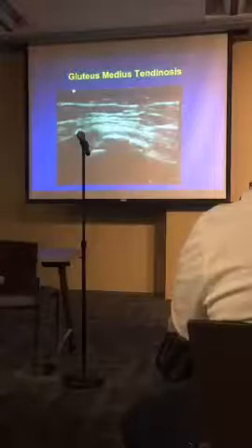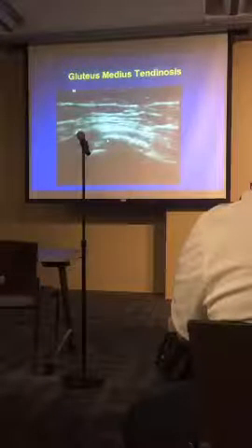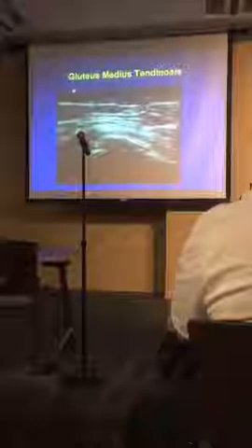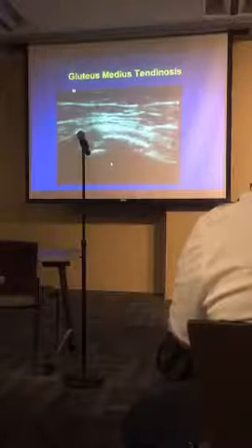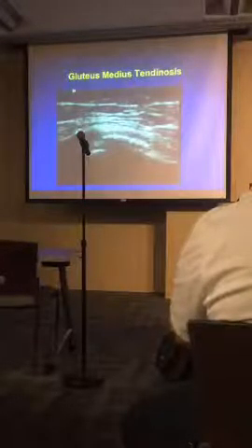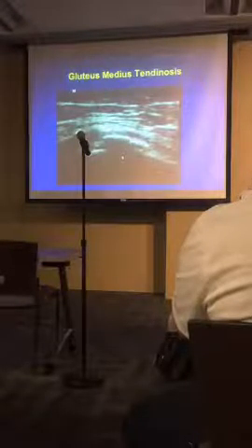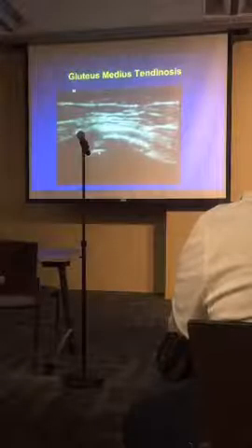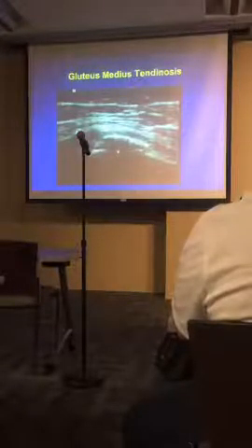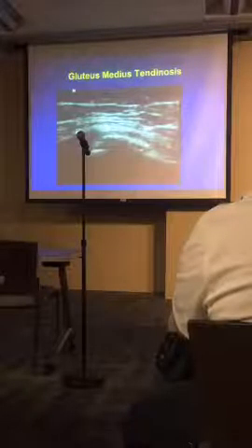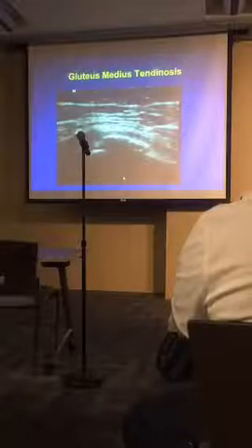Larger calcifications appear as echogenic structures with posterior acoustic shadowing — the calcification reflects and also absorbs the beam, so you lose information behind it. An example in the gluteus medius at the hip shows the calcification creating a gap in the apparent bone surface of the greater trochanter — not a real gap, but the calcification absorbing the ultrasound beam. Posterior acoustic shadowing is a hallmark of calcifications.